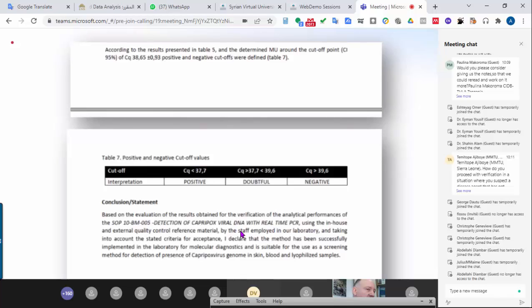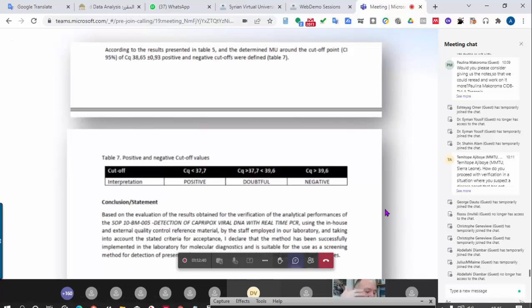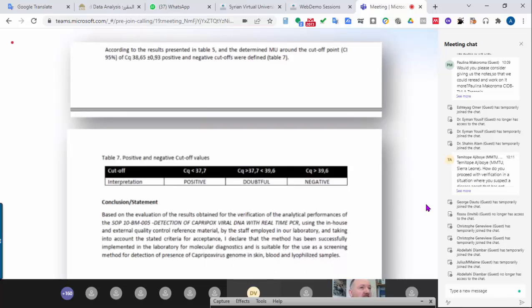provide the interpretation in your SOP, and this will depend on many factors. Most of them, the intended purpose, is it the confirmatory method, for which disease, I think I mentioned this previously, whether or not you should report an outbreak of a new disease, an emerging disease, and it will also be influenced by the clinical and epidemiological situation.